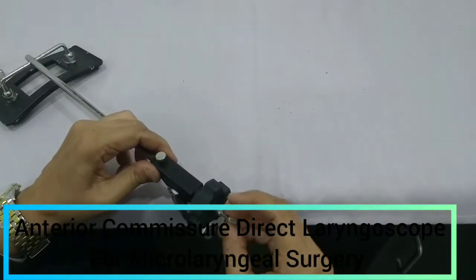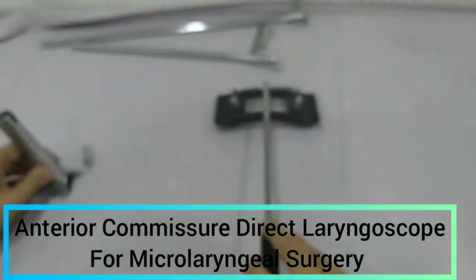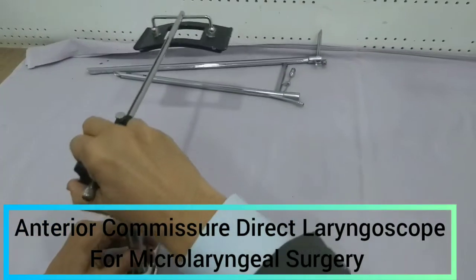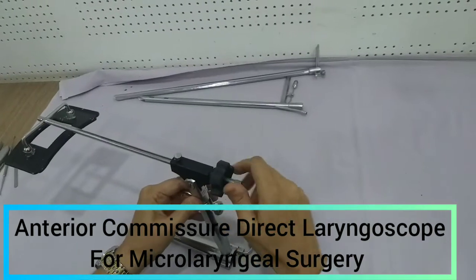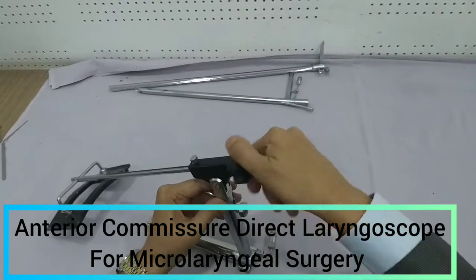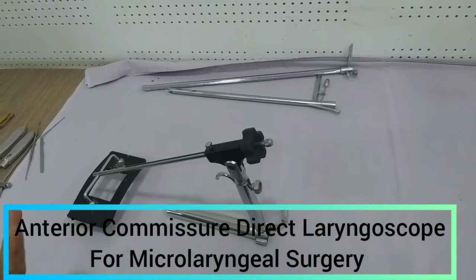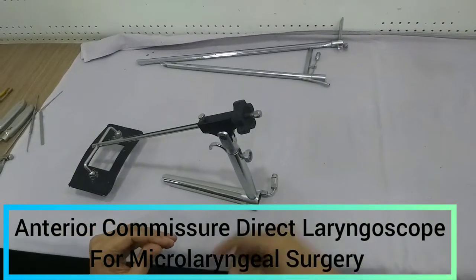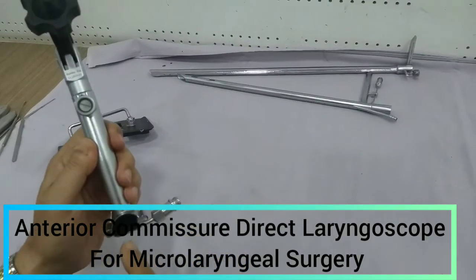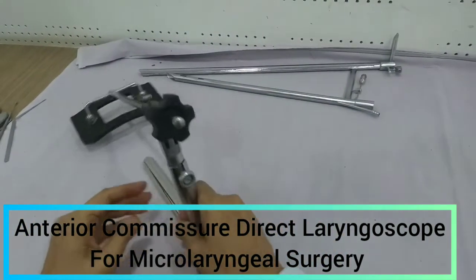It can be introduced like that, and you can just screw it. This end will go into the throat — you can understand. And this will be attached here, and then it can be fixed. We can bring it down like this with the help of this chest support, so this portion will remain on the chest. Once fixed, both hands will be free, and with free hands we can manipulate, examine, and perform surgery on whatever lesion is in the larynx — all through this hollow metal tube.